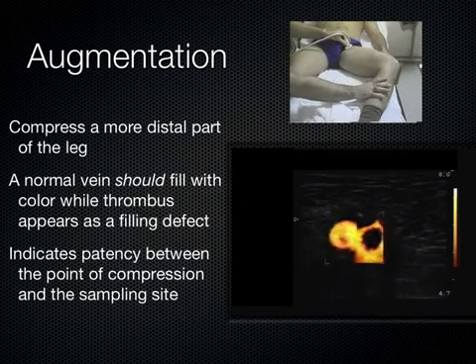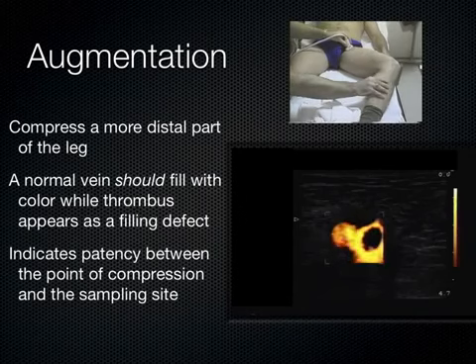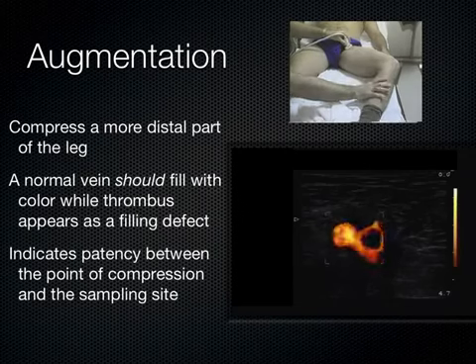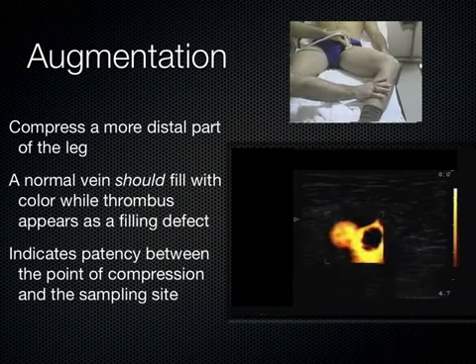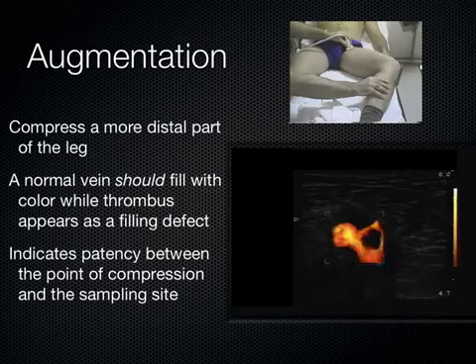Okay, that hemodynamic stuff we were talking about earlier, that's pretty high level stuff right there. This DVT stuff, really straightforward. And so this is one more reason why I am so passionate about teaching medical students ultrasound, is that when these machines are in your hands, when you're in practice, no matter what field you're into, you will always feel confident about your abilities to rule in or out a DVT.